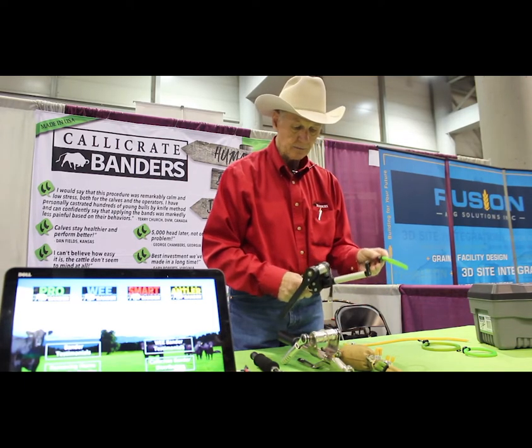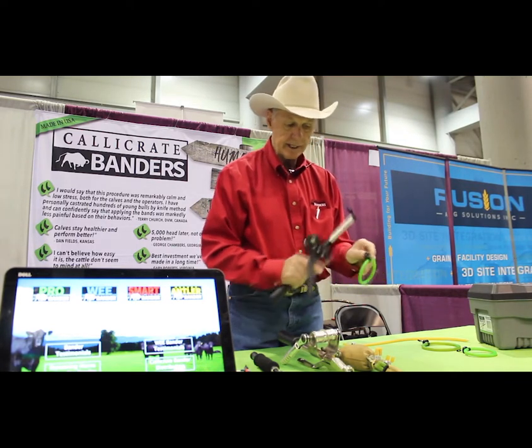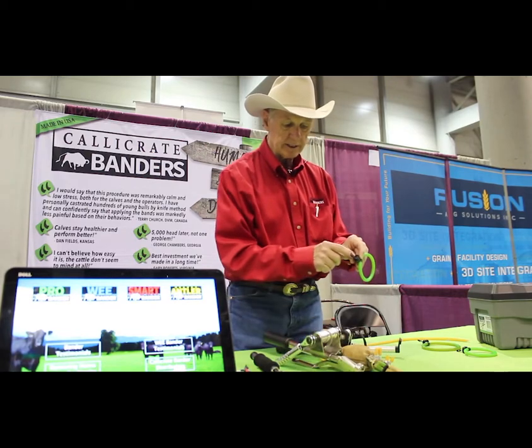The difference is it's all aluminum, it's lighter, a little more compact, and there's a self-catching clip on the band itself, and that eliminates the crimping process.